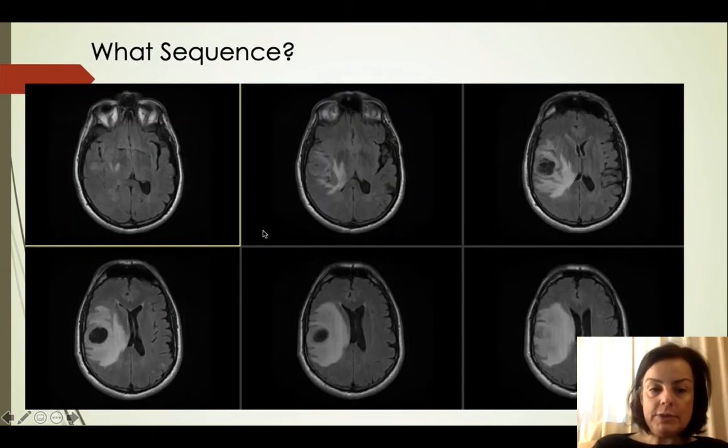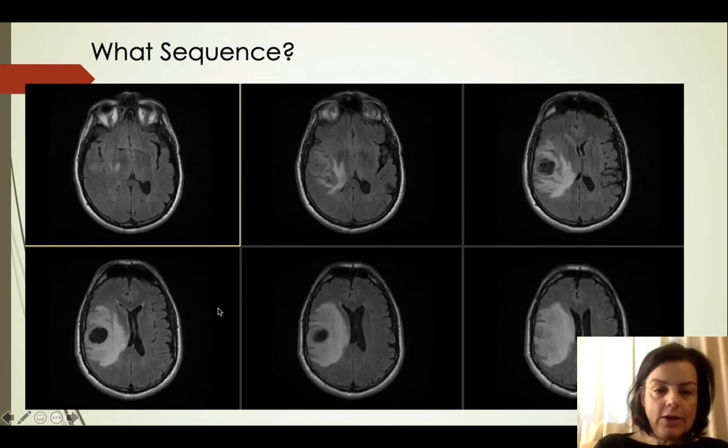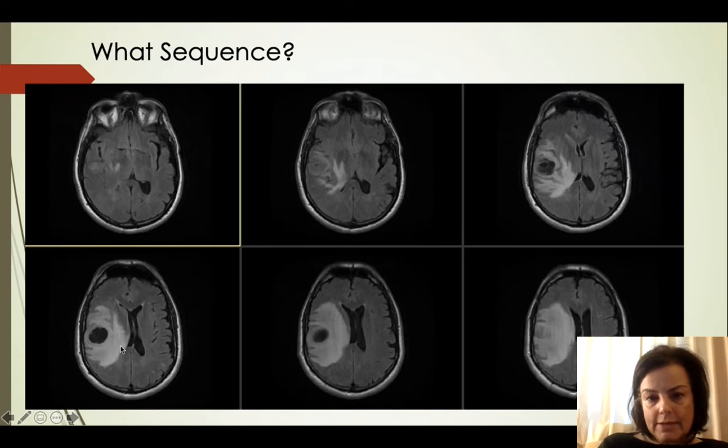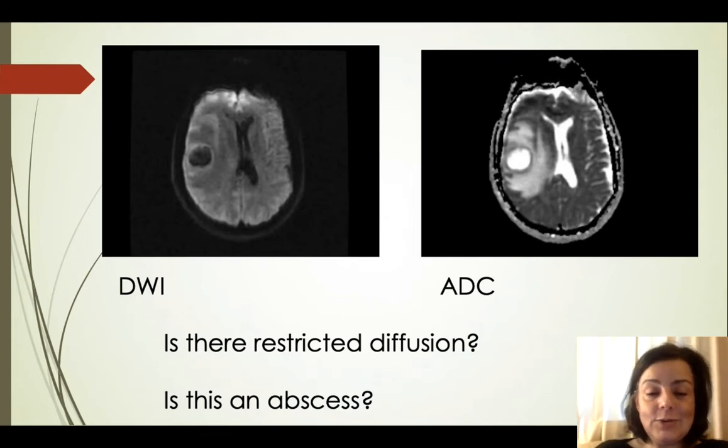So then this, of course, would be FLAIR. And you can tell that because of the gray matter and white matter, and the CSF is dark. These are the same cut, as you notice, so we're not going to see a whole lot new. But FLAIR really does make the edema pop. All of this is edema, vasogenic edema, and that really pops out when you have FLAIR.